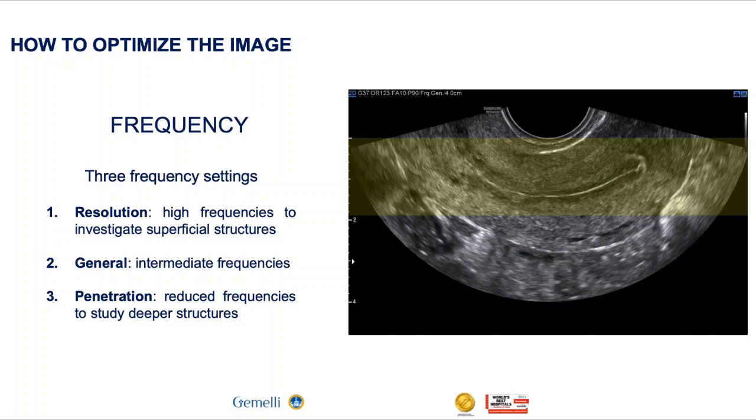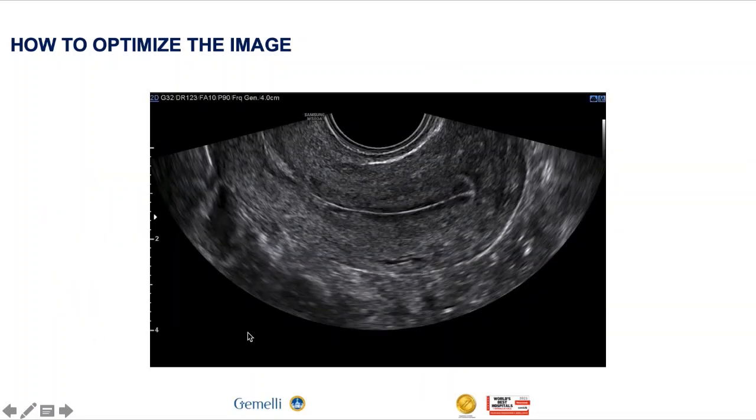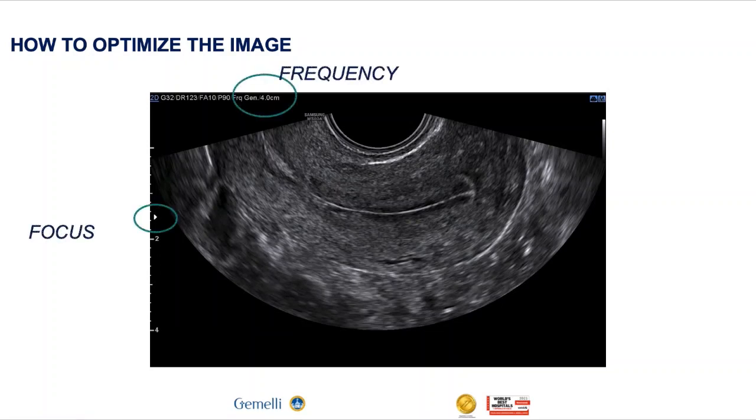However, we usually use general frequency. We can also use penetration, meaning low frequencies, to study deeper structures. The general frequency and the focus in the right position.